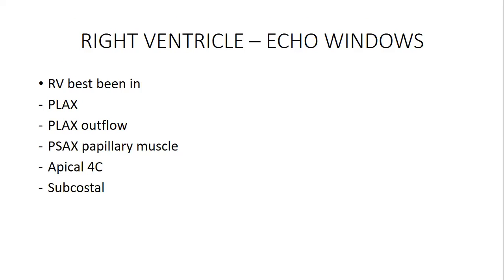When you are looking at the right ventricle, you have to know in which windows you see the right ventricle. And even if you see it, which is the best window where you can quantify the measurements, the parameters, and those hemodynamic measurements that you need to do. I should mention here that you should never conclude an echo report or echo diagnosis on one image.